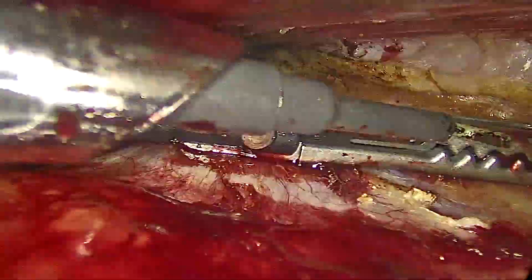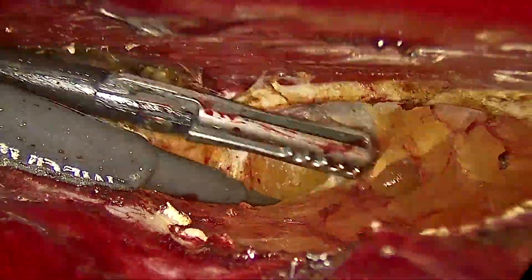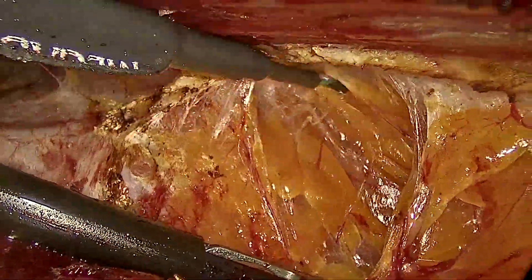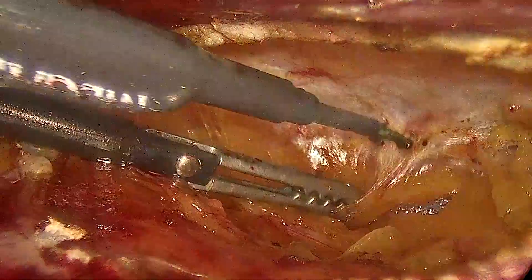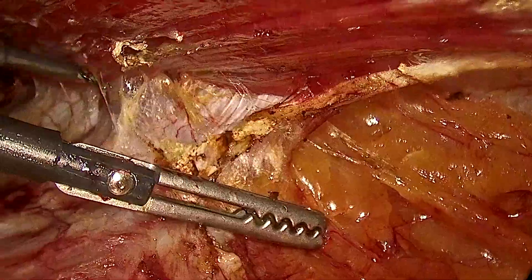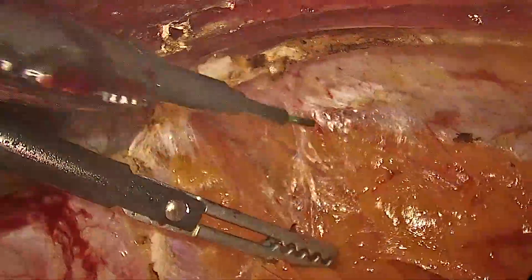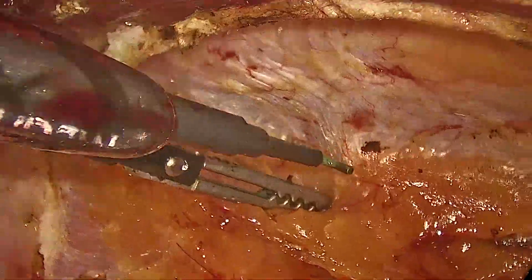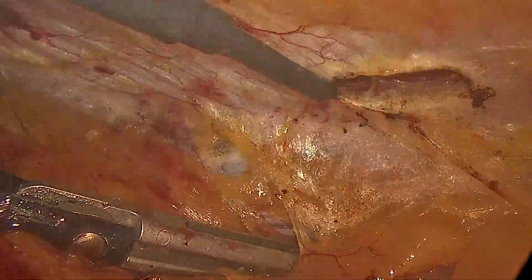We follow the same known steps of bluntly developing the ipsilateral retromuscular space, performing the crossover, dissecting the preperitoneal space, and then dividing the medial aspect of the contralateral posterior rectus sheath to develop the contralateral retromuscular space.